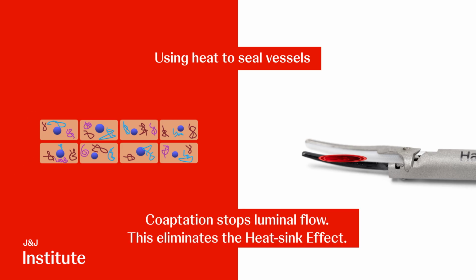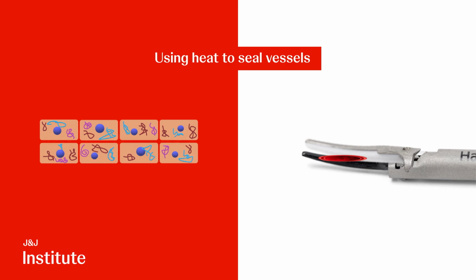Coaptation or compression also halts blood flow within the lumen, preventing a heat sink effect that would otherwise cool the area.